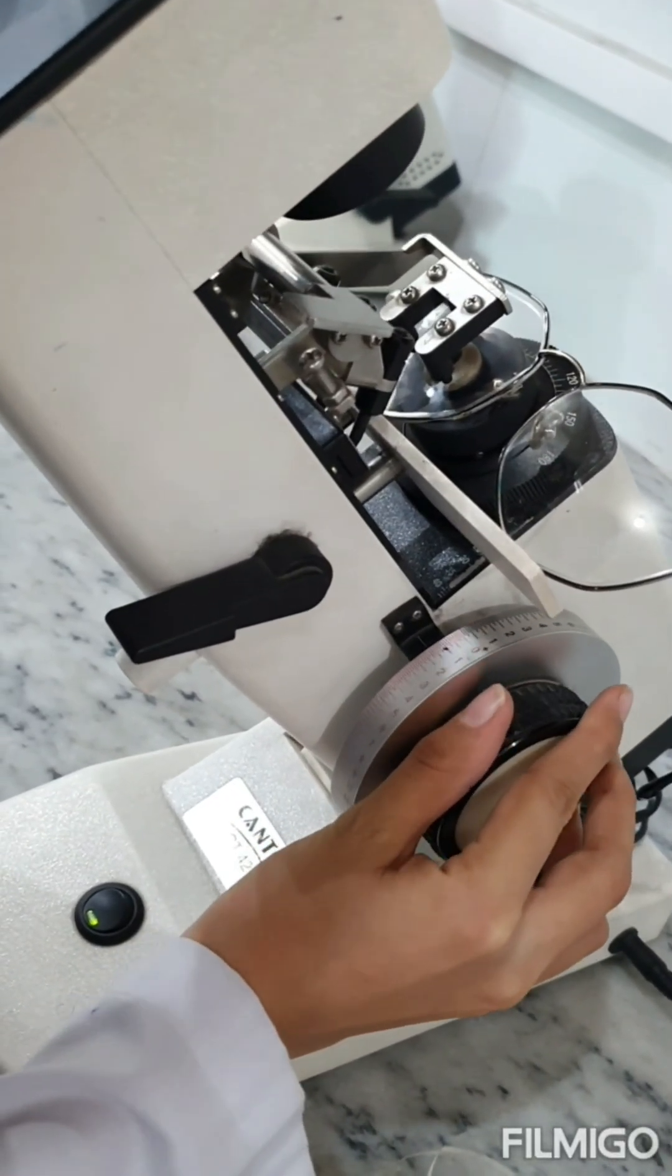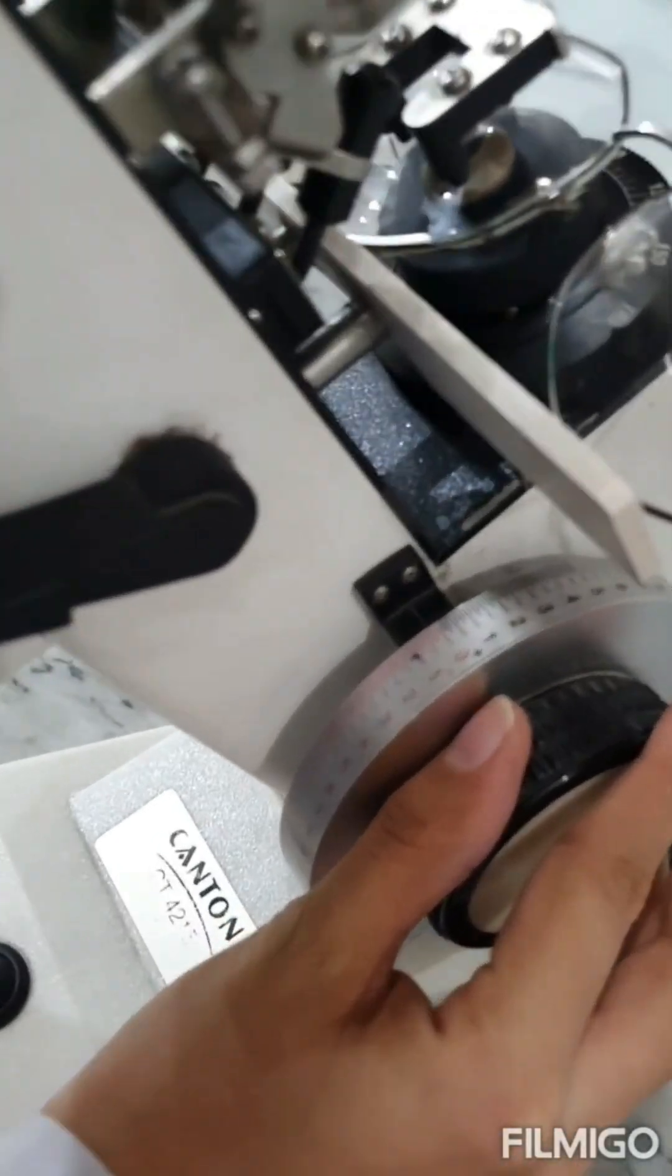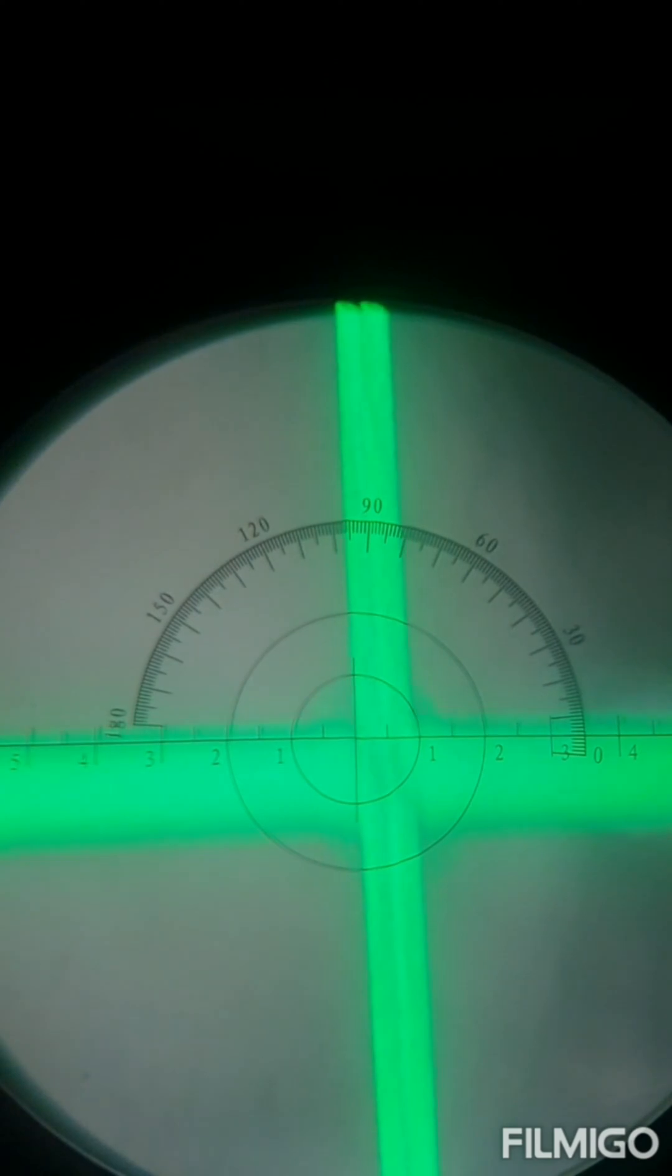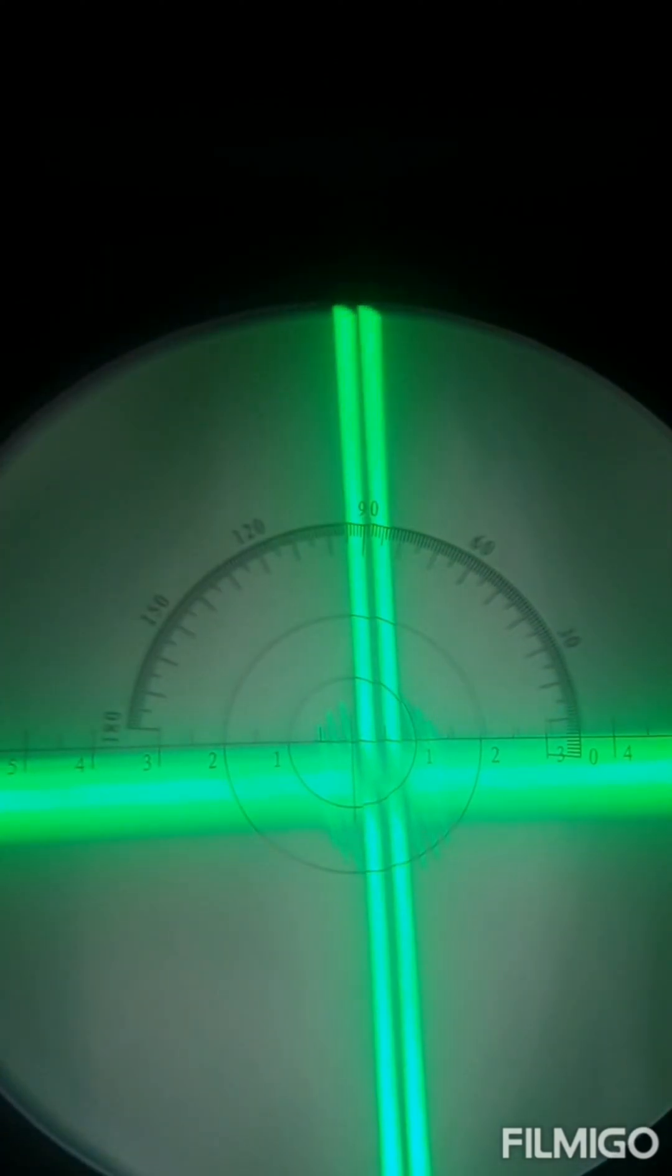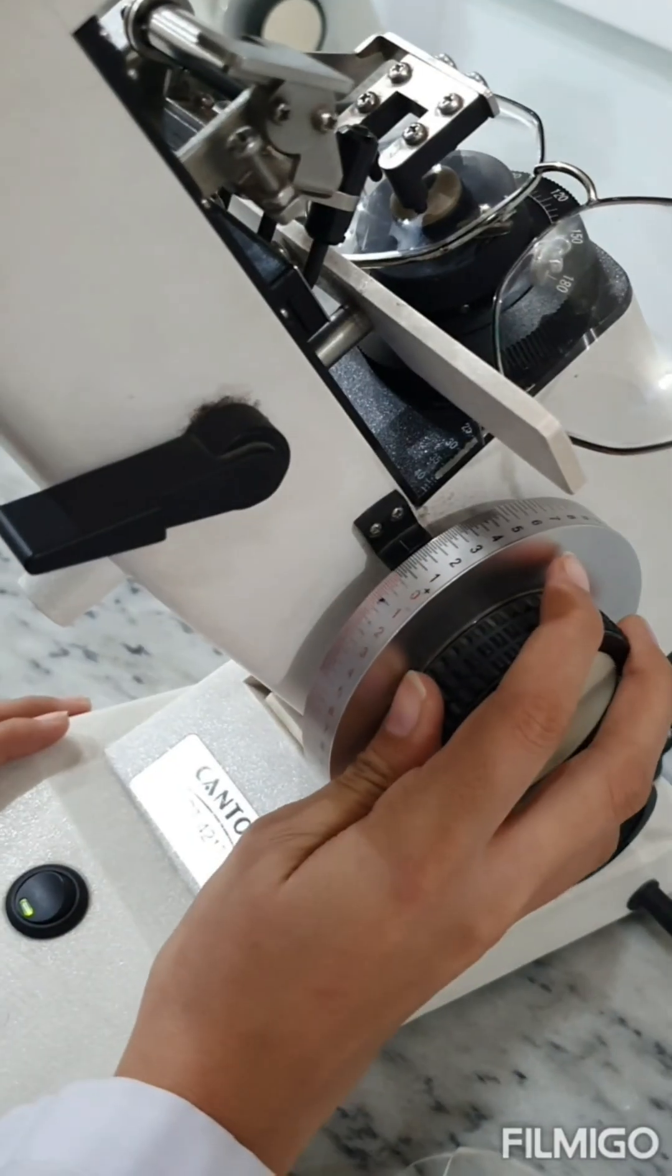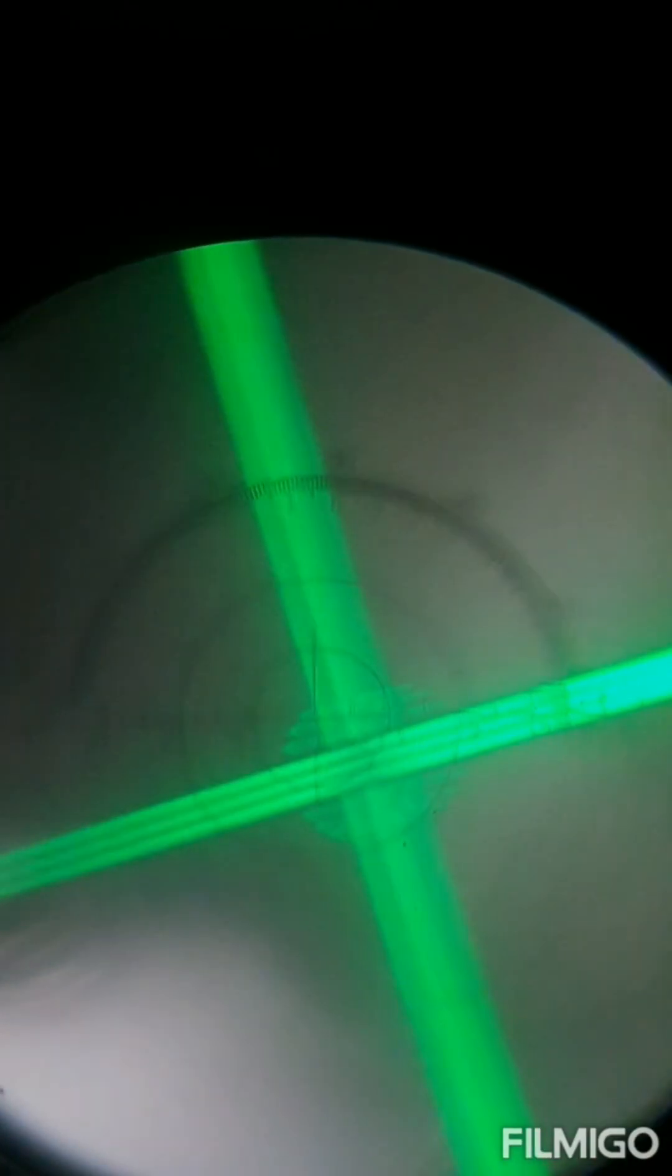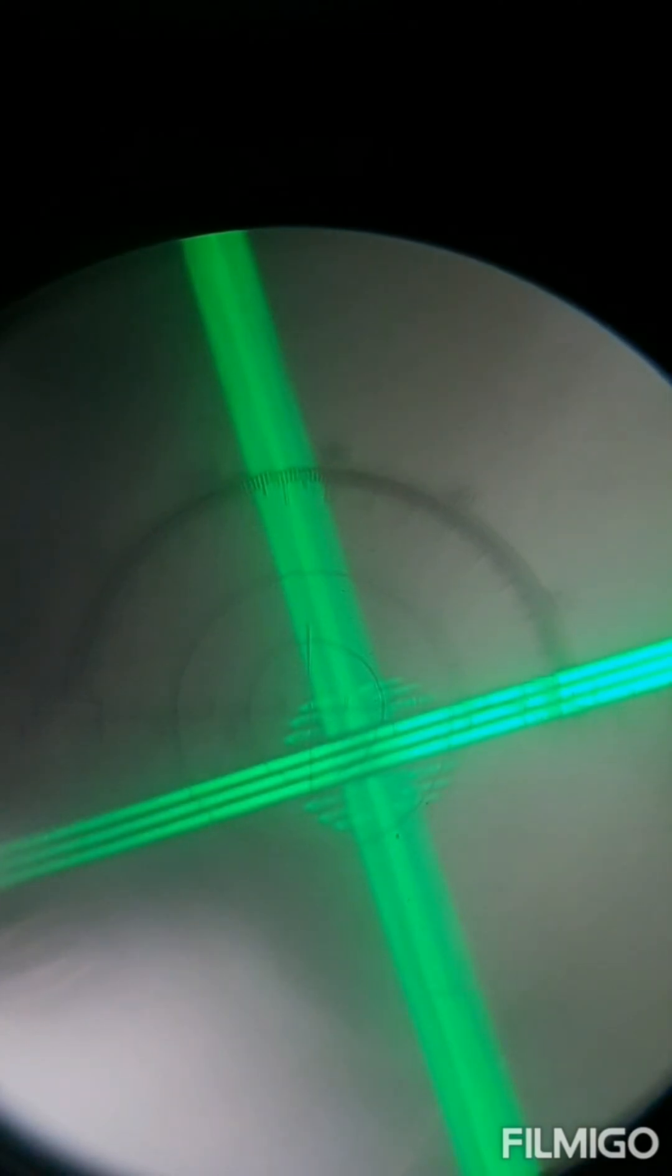You can see from the eyepiece that the vertical meridian is now clear and sharp. While observing from the eyepiece, again rotate the power drum so that the opposite meridian becomes clear and note the readings.